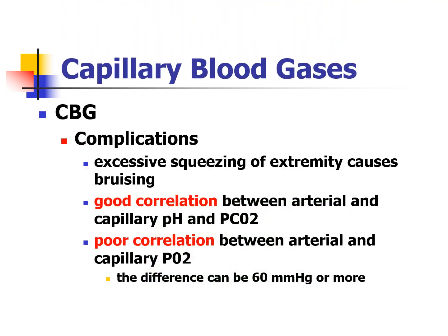So this is something that you'll do up in the NICU, and hopefully if you're at a clinical site, ask if they do cap gases, if you could see one. They're pretty darn cute.